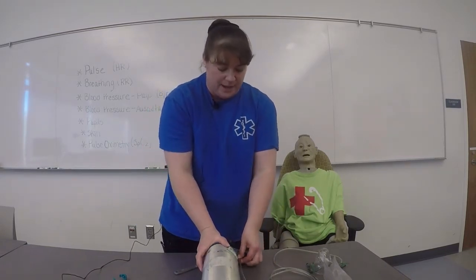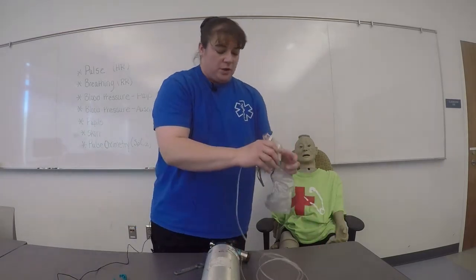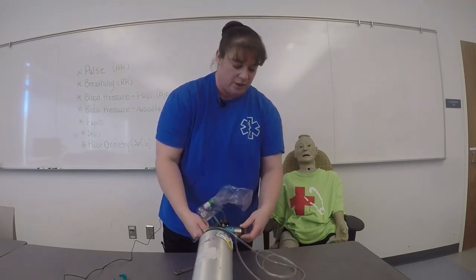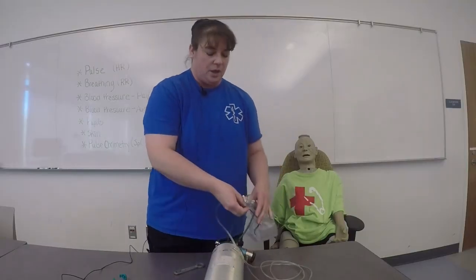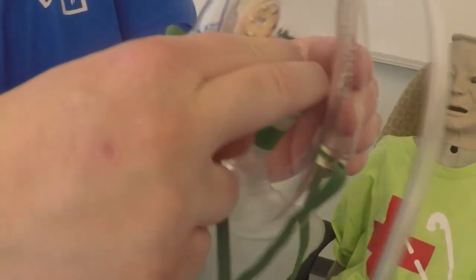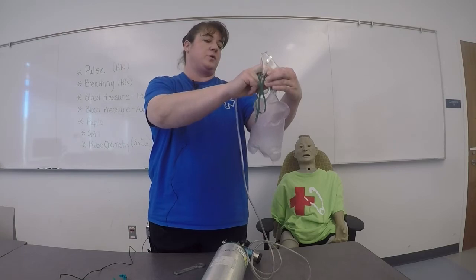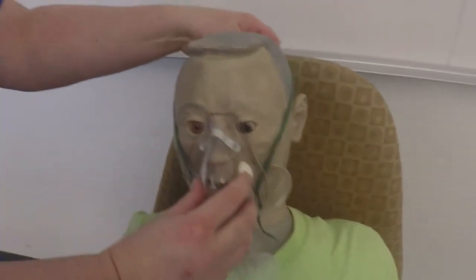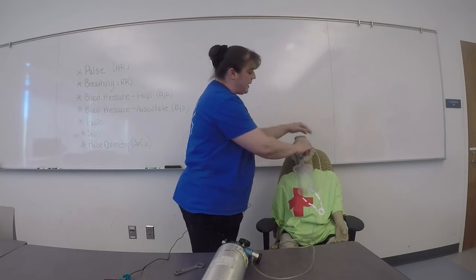Attach the non-rebreather mask. Then, with the tank in the on position, turn the regulator to 15 liters per minute, which is high flow oxygen. I'm going to place my fingers over the one-way valve to pre-fill the oxygen reservoir. When the reservoir is full, I'll work with the patient to place the mask over the mouth and nose, and when the patient's comfortable, I'll slip the elastic over the back of their head.